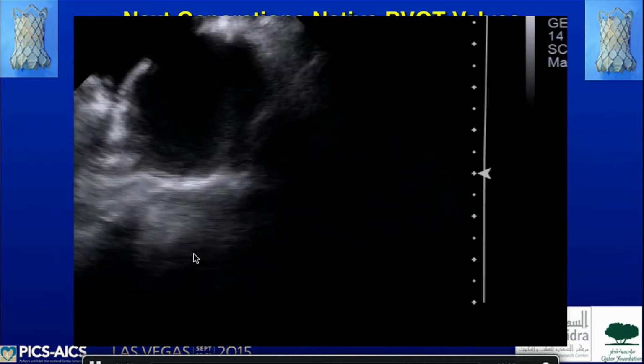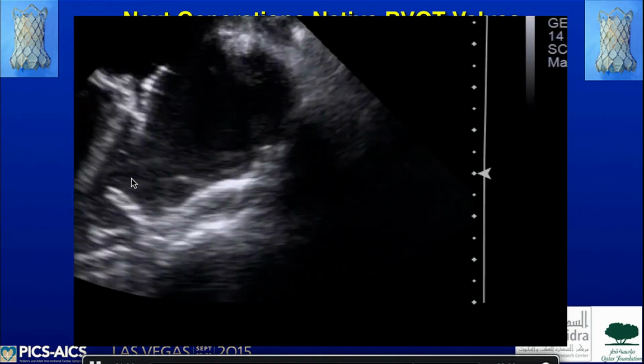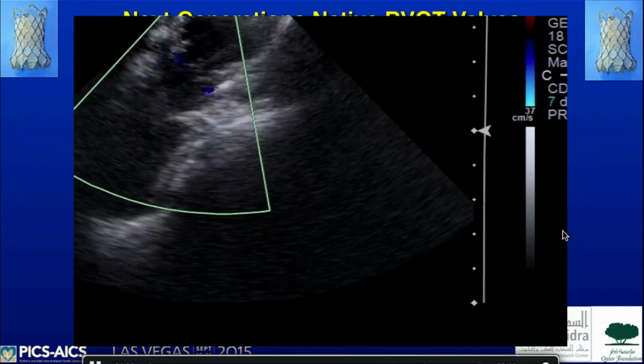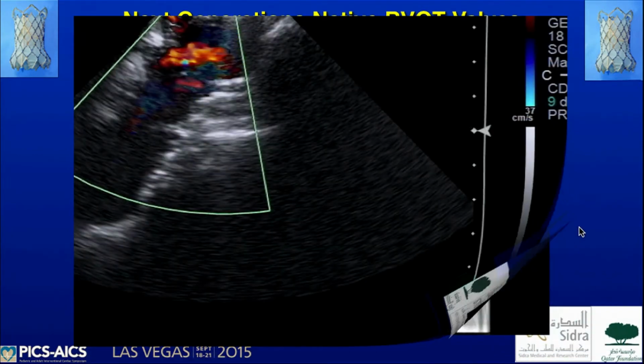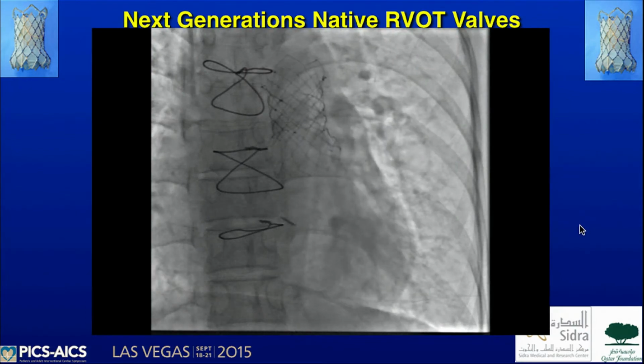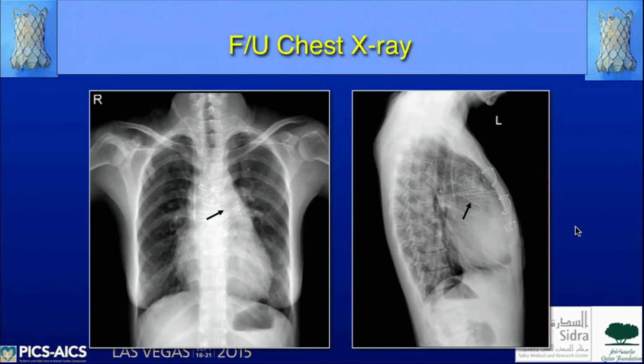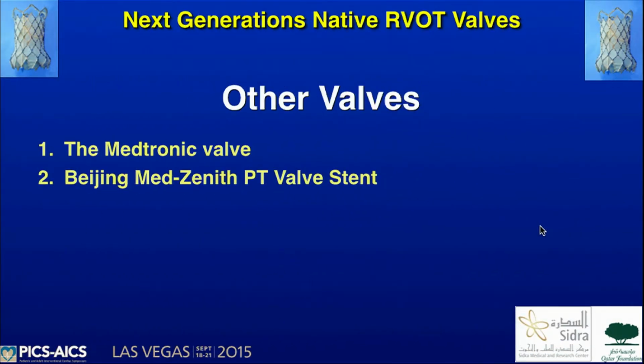And this is intracardiac echo I did during the implantation. You can see the valve leaflets very nicely and no pulmonary insufficiency at all. This is a quick cine shot to show you the radio opacity of the valve. Chest X-ray the following day again shows the valve frame. So this is the Venus P valve.